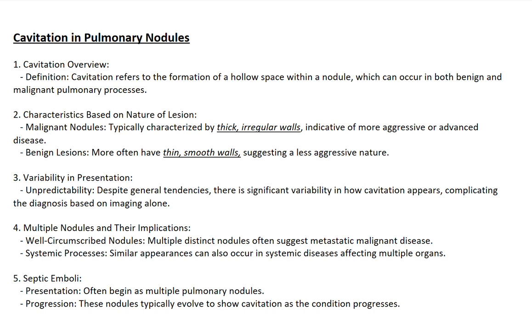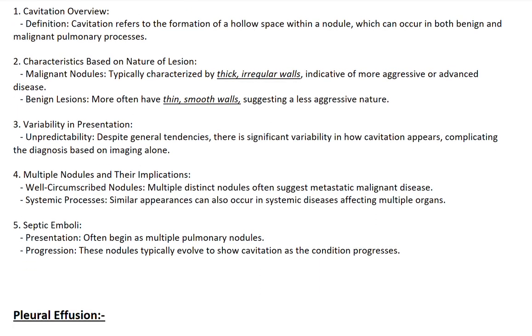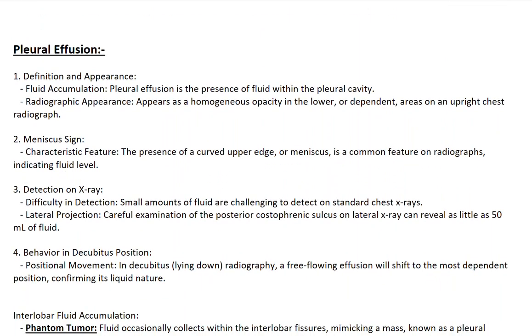This structured overview highlights key features and differences in cavitation associated with pulmonary nodules, aiding in the differential diagnosis between benign and malignant causes based on radiographic characteristics.